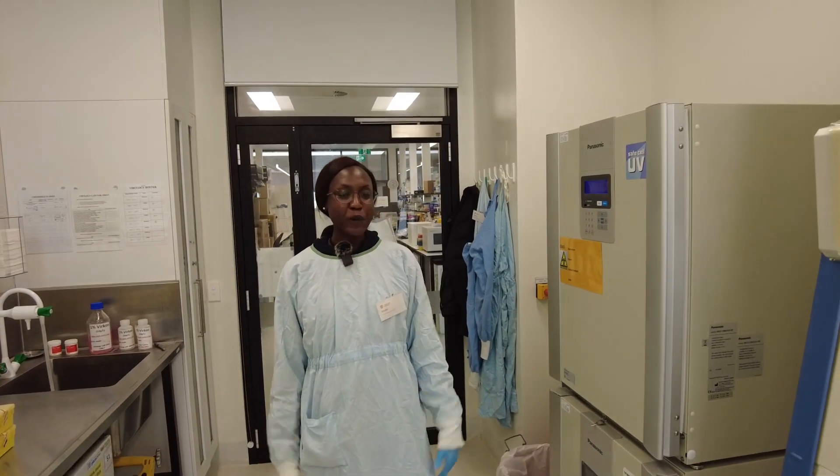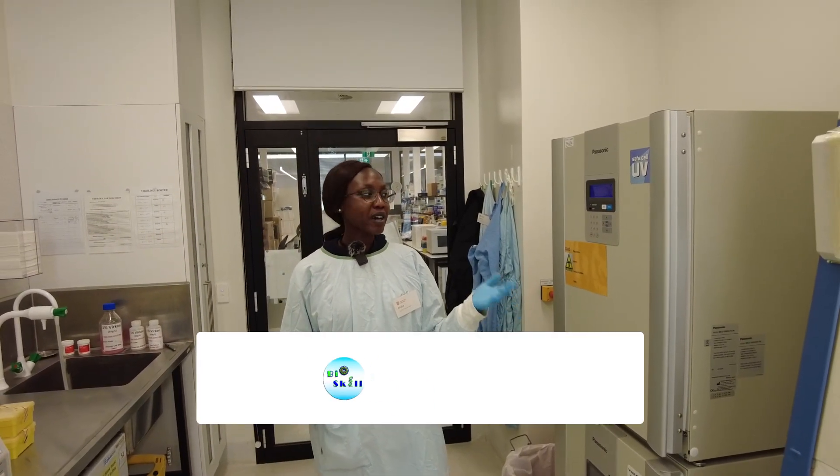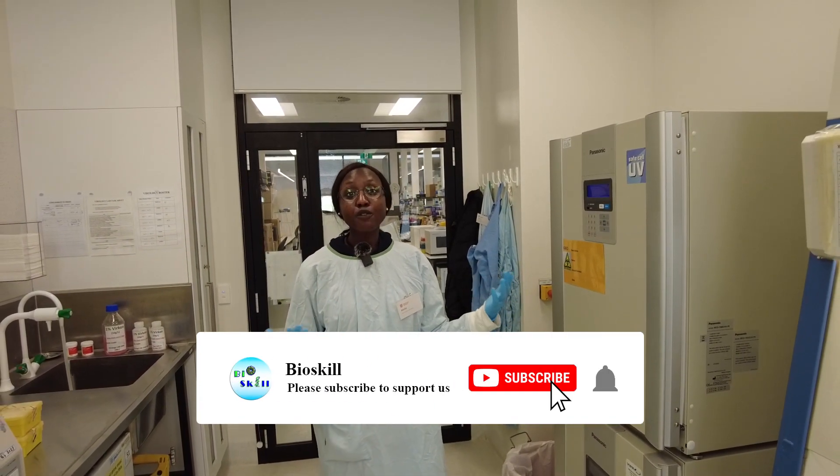Hi everyone, my name is Aduba and we're in the cell culture room today. I'm going to walk you through the different equipment that you need for cell culture.